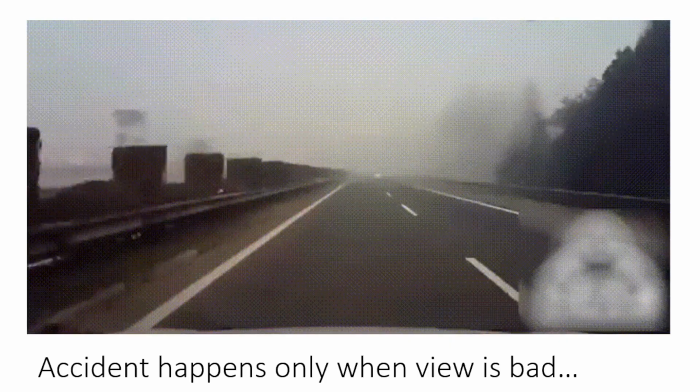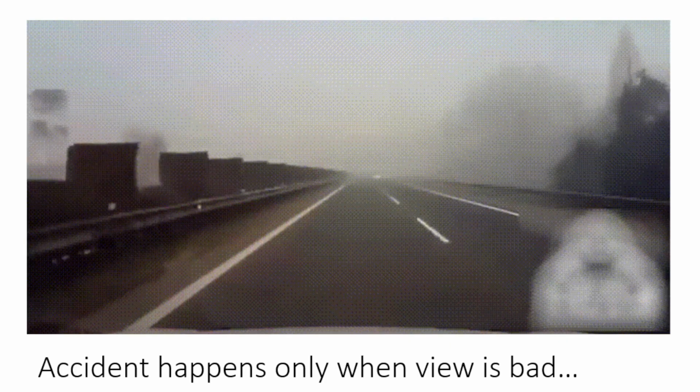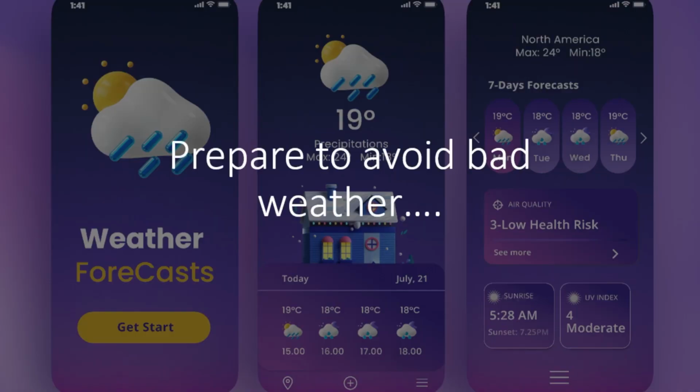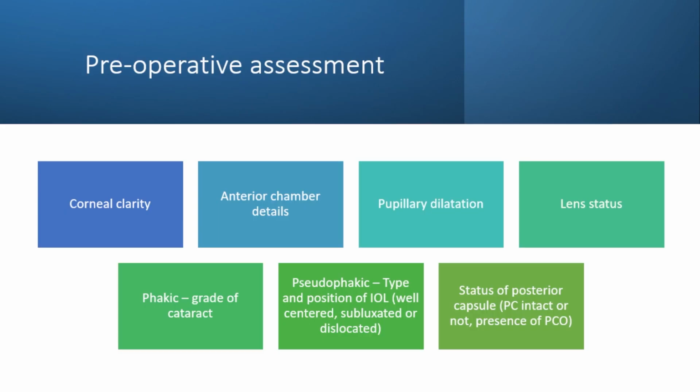So, what happens when the view is bad? Accidents happen only when the view is bad, right? So, prepare to avoid bad weather. How do you prepare to avoid bad weather during vitrectomy? Preoperatively, you will have to assess the patient thoroughly with slit lamp examination and carefully assess certain parameters that will help in planning the surgery.